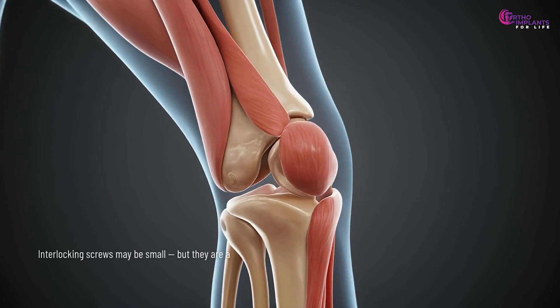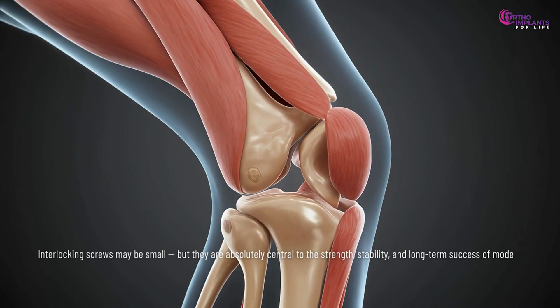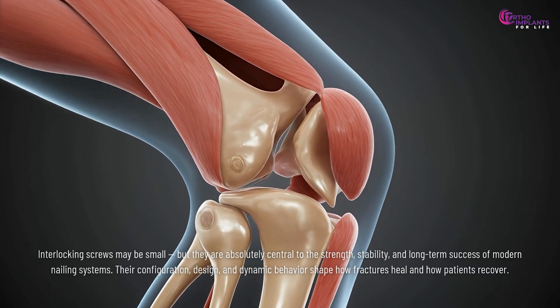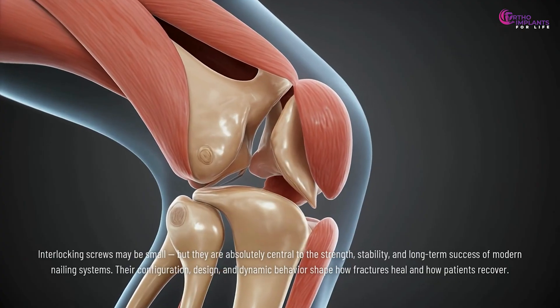Interlocking screws may be small, but they are absolutely central to the strength, stability, and long-term success of modern nailing systems. Their configuration, design, and dynamic behavior shape how fractures heal and how patients recover.